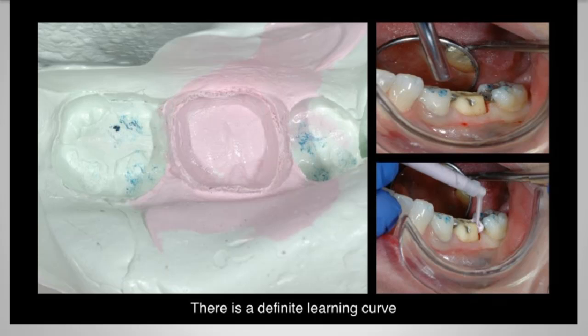In stage 1, you still need to do hemostatic control, so you still need to use your hemostatic agents. But once you do that, there's no additional soft tissue retraction that's completed here. An impression is then captured. And quite frankly, there's a learning curve to this. It's not a technology where impression number 1 out of the box is necessarily going to work, but you're going to need to get comfortable with it.